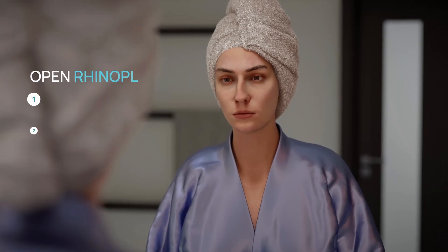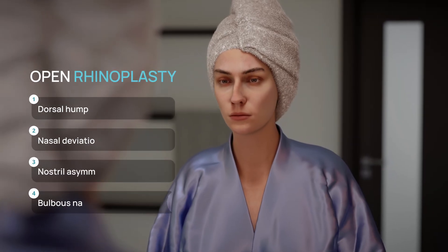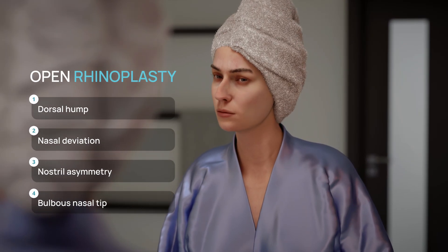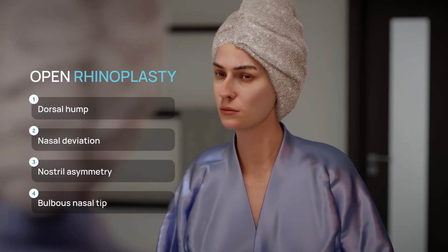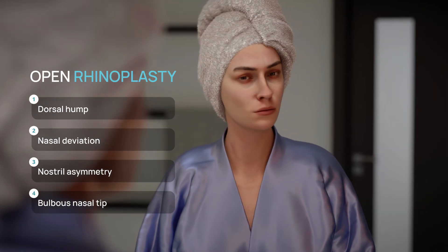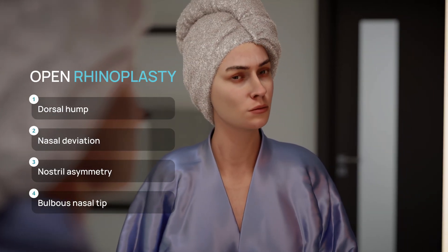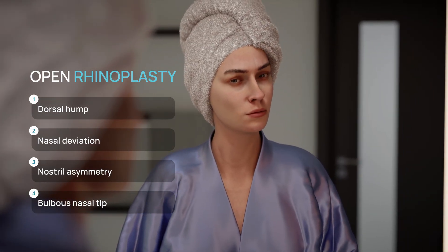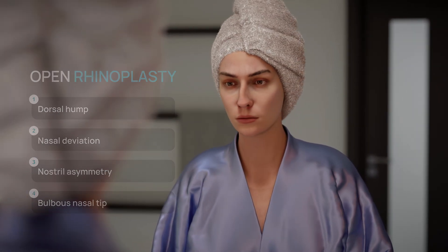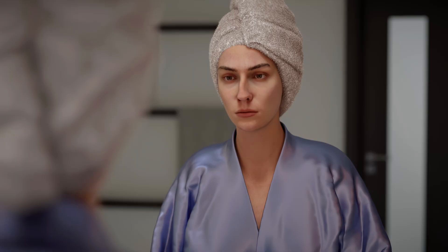Rhinoplasty ranks among the most commonly performed procedures in plastic surgery. The surgery aims to correct both functional impairments and cosmetic deformities of the nose.